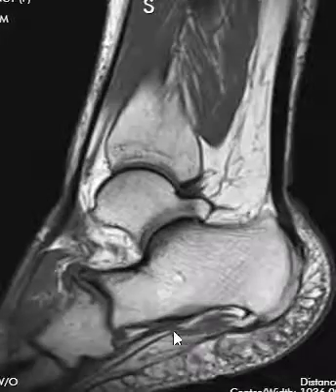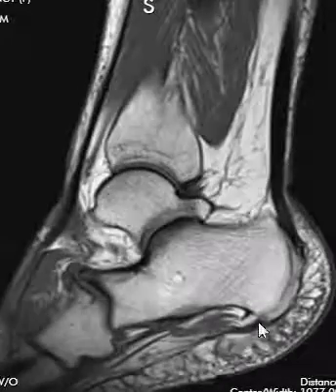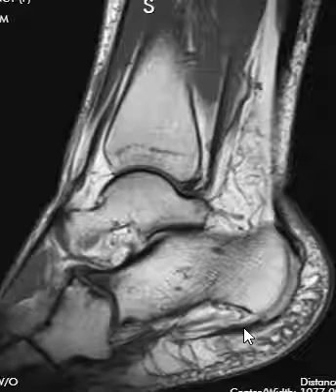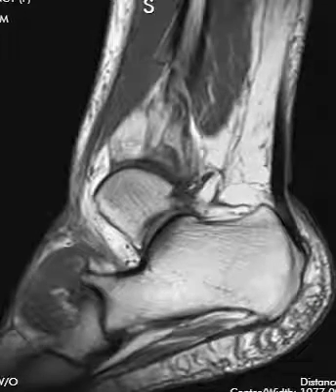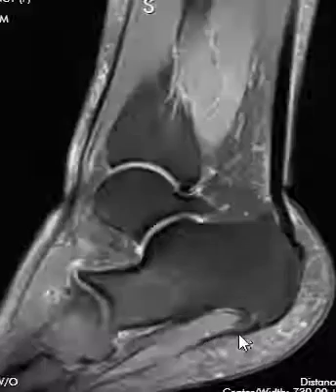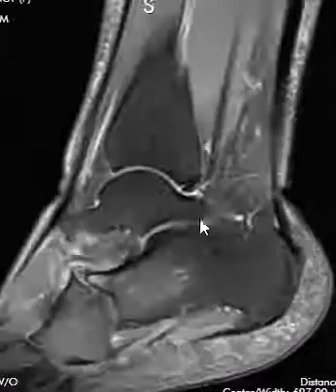We also look at the calcaneus to see if there's any spurring along the undersurface — and this patient does have a little bony spur here. Then we see this thing along the bottom coming off that spur, which is the plantar fascia, this linear band here. We look at the plantar fascia to see if it's thickened or if there's any inflammation, which would be called plantar fasciitis. Their fascia looks pretty good here — a nice linear black line.